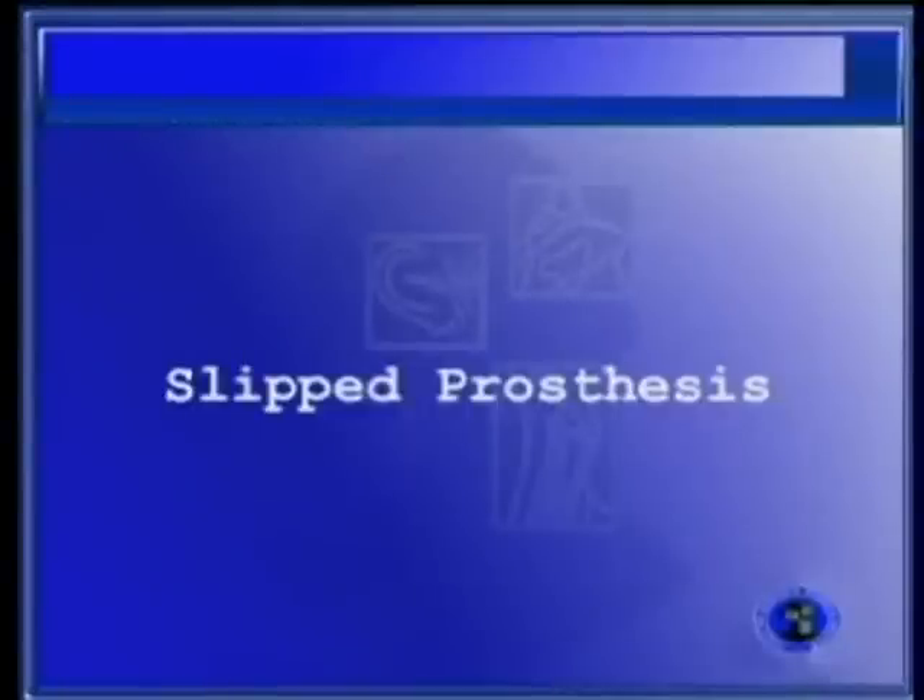In this video clip, we show you the management of a slipped prosthesis. This is the right ear. The patient is under local anesthesia, as in all our cases.